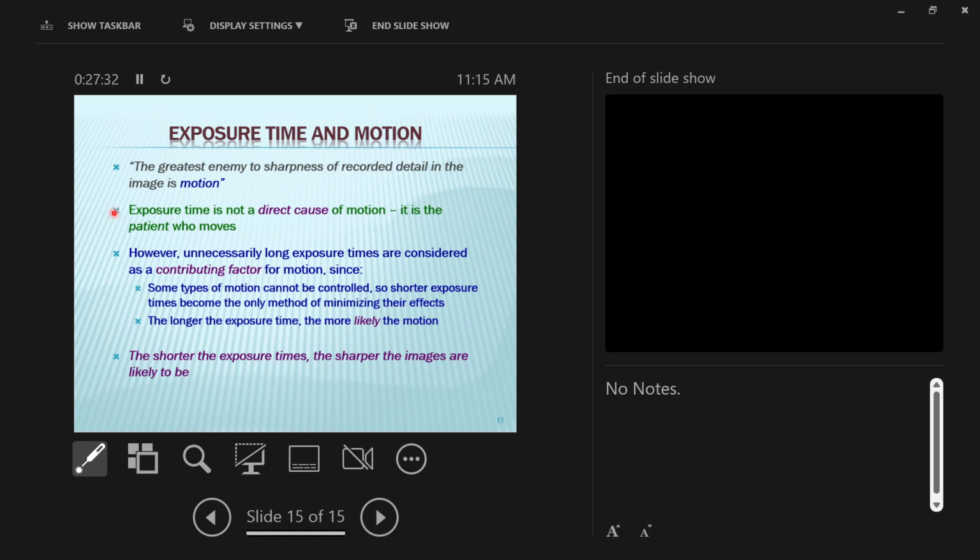detail, by minimizing motion. Said in the simplest way possible, everything on here considered, the shorter the exposure time, the sharper the image is likely to be due to patient motion. Okay, if you can minimize the evidence of motion, you can maximize detail. And you know that because when you take a picture of somebody, you have them hold still, right? Or you take it in a good lighting setting, so the amount of exposure time can go down. I'm talking about literally a camera, right?